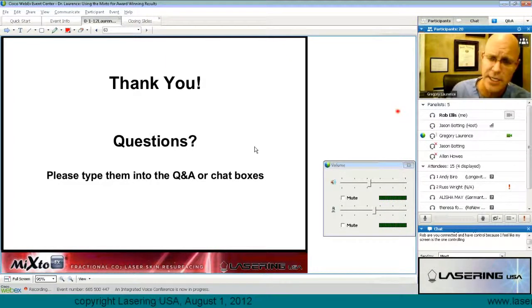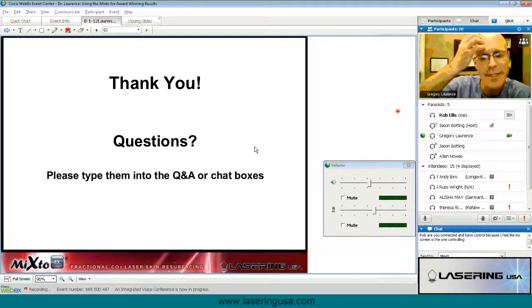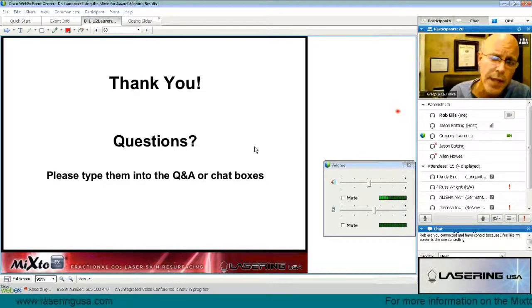And just be patient. I've seen a lot of my colleagues do this without a single assistant. They just do the laser, the patient feels something, they put the anesthesia in, wait a couple minutes, and go. I don't know what your time is worth, but this is a very high dollar procedure. If you have to sit there with the patient for 3 hours lasering, because it's what you love to do, and making sure they're anesthetized, there's all kinds of other things you can do to help patients relax, whether it's an oral cocktail, whether it's nitrous, which all of our dentist colleagues have learned to use very well. There's a lot that you can do to get patients comfortable.